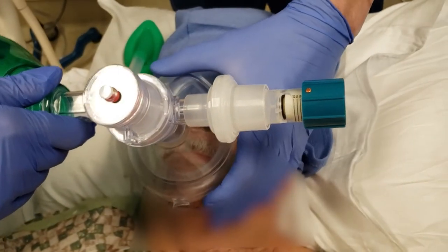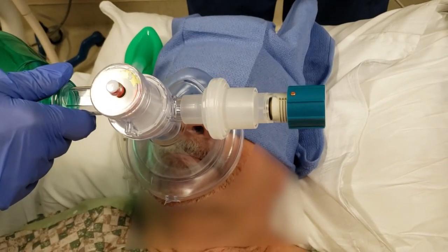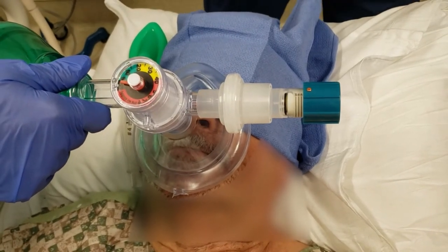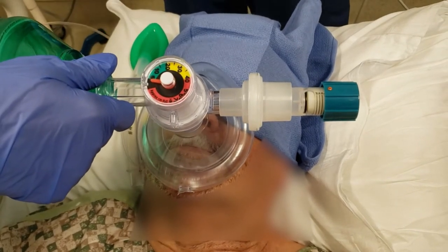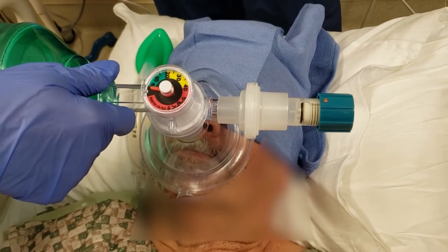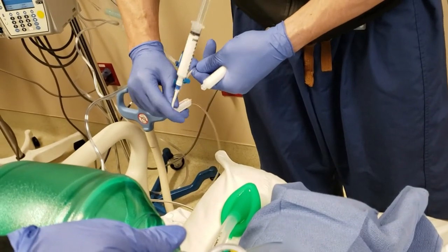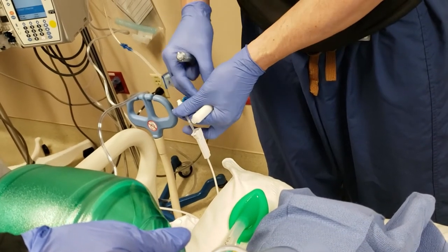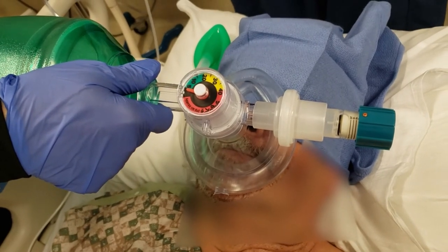We are just pre-oxygenating our patient right here. The pre-oxygenation helps take out all the nitrogen out of the lungs and allows us a longer time to place our device — usually about 2 or 3 minutes is sufficient. We're going to go ahead and do our induction for our LMA. This is going to be 200 mg of propofol, which is about the usual intubation dose for about a 100 kg patient — anywhere from 2 to 2.5 mg per kg.